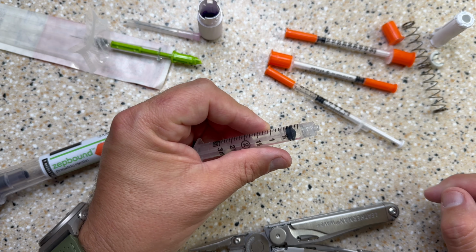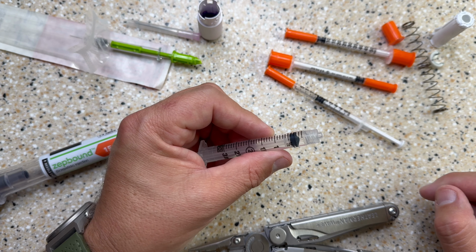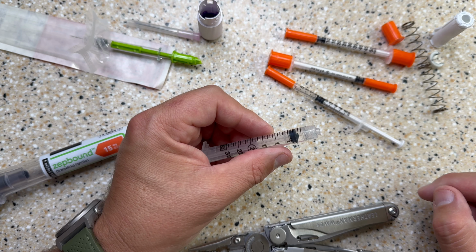And then when you're done, safely discard of your waste, wash your hands, and you're good to go.